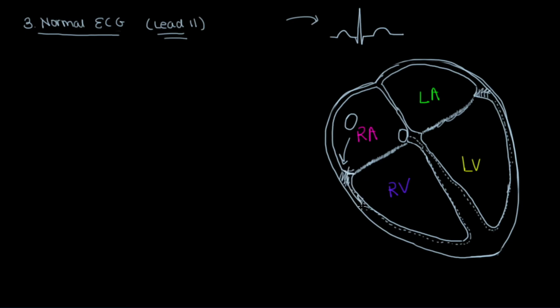It won't go through and propagate and depolarize other areas of the heart, at least in a normal heart. So I just wanted to give you that caveat there, or that explanation there. So I think a good way to visualize how this is overall formed is by going through in order how the depolarization process happens.